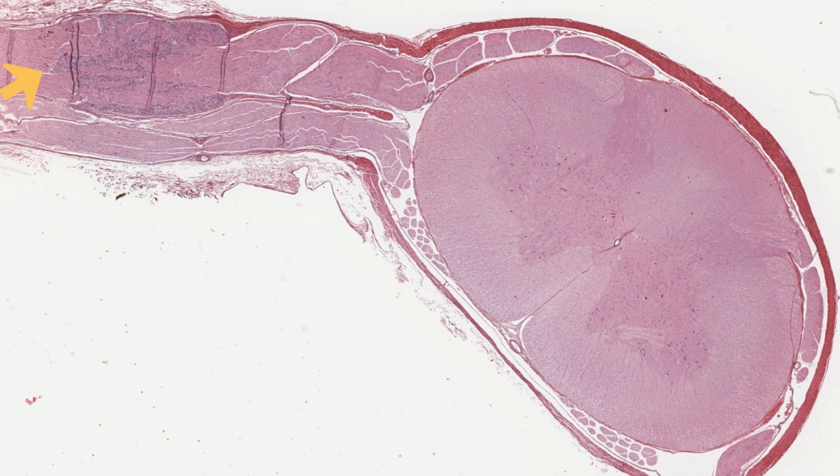Of course, this peripheral nerve will extend much further, but it's run out of the plane of section distal to the ganglion in this section. So what I have described in the earlier topics in this lecture series was the histology of a typical peripheral nerve at this level or further distally in the limbs.